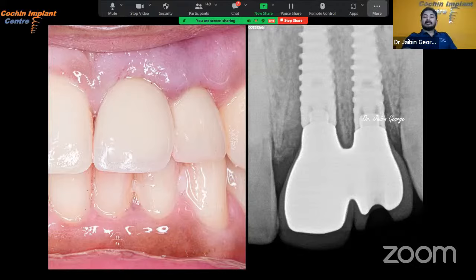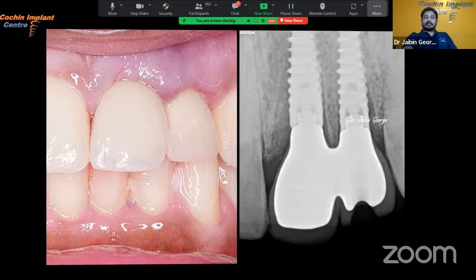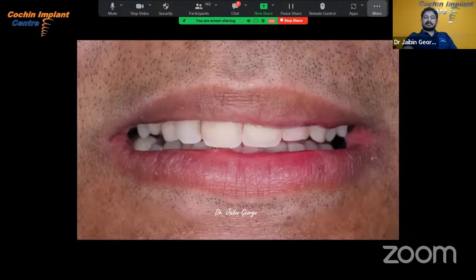The patient leaves the office with the teeth. No waiting period. Later, if needed, we can change the crown because it's easy to change, as these are screw retained crowns. Just unscrew it, make another impression, and we can fabricate another crown. And this is the final result of the case.